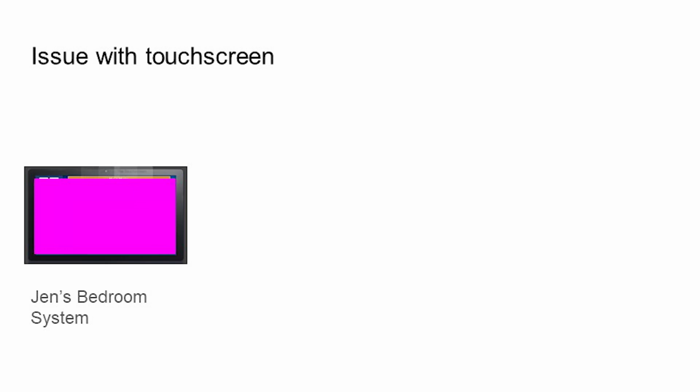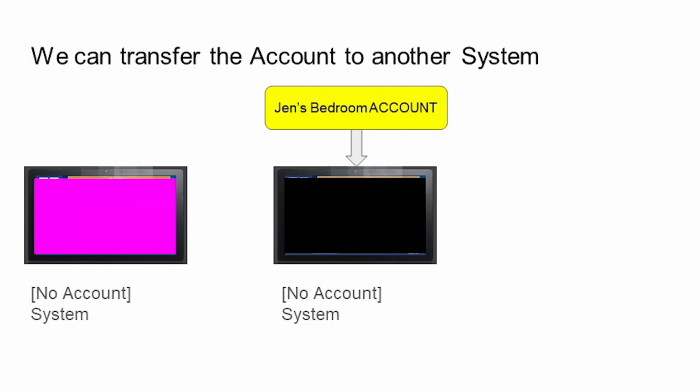Fortunately, we have the ability to transfer the identity of that previous touchscreen to a new piece of hardware. And the identity is what we call an account.